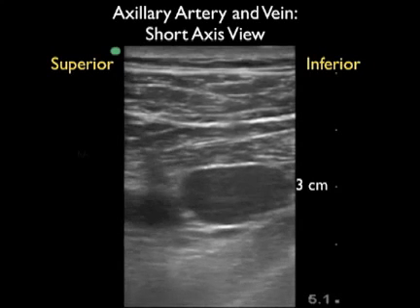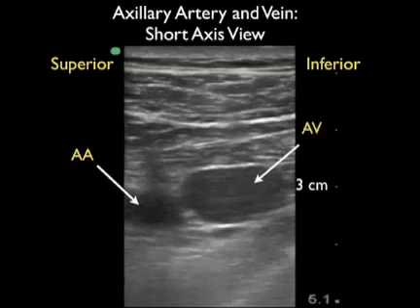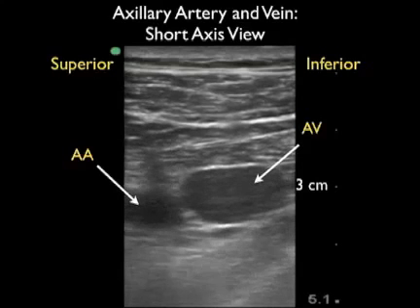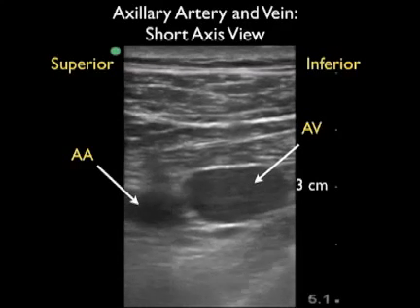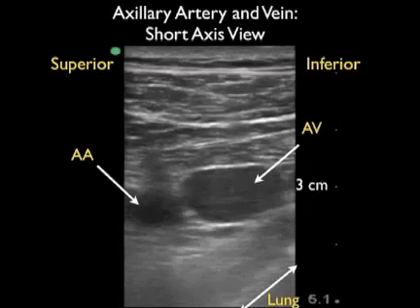Here are some ultrasound images of the axillary vein and artery taken from the short axis view. We have the probe marker oriented towards the patient's head, thus to the left of the image is superior and to the right is inferior. We notice the axillary artery, the smaller vessel, superior or towards the left of the image. We see the larger axillary vein at about the 3 centimeter mark, inferior or towards the right of the image.